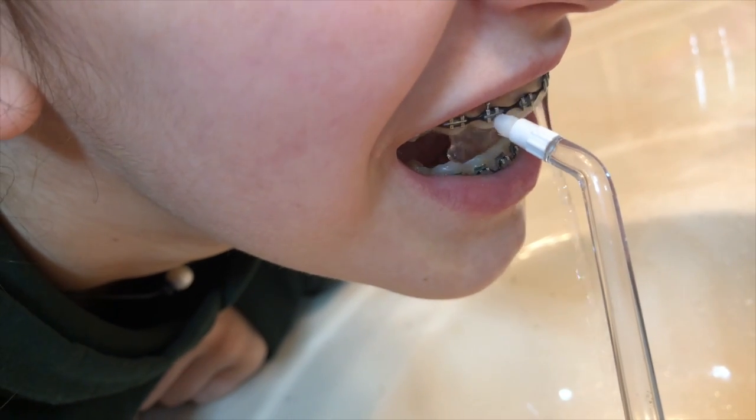Another little tip that might be helpful, maybe for an older child, or let's say a real conscientious child, is maybe you put about an inch or a half inch of water in the sink if you're helping them use it in the sink. Or if they want to sit down, if you have somebody that's wheelchair bound, I would put a towel in their lap and put a large bowl in their lap, and have them help you by catching it if you're doing it.